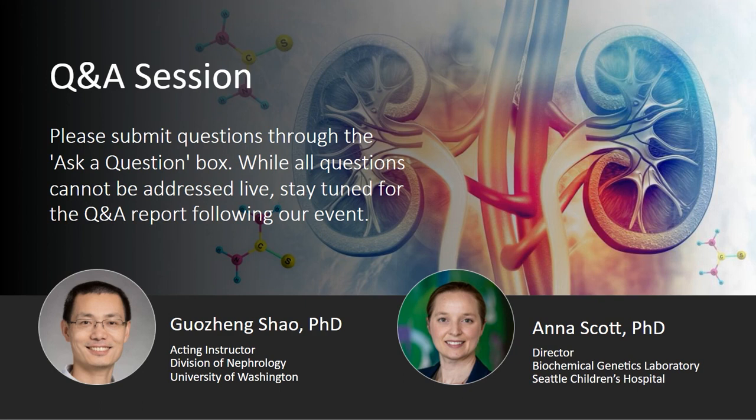There's actually a wonderful paper out there about how repeated analysis by tandem mass spec of free amino acids failed to diagnose prolidase deficiency because dipeptides are not built into these libraries. It's very rare to see them. And so in that scenario, the classic HPLC ion exchange and ninhydrin amino acid analyzers are the better instrument.